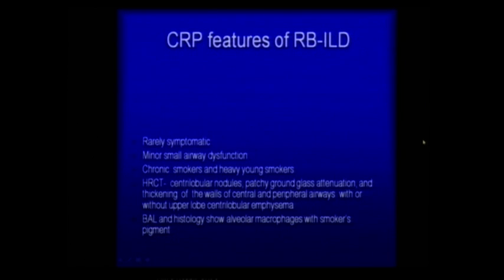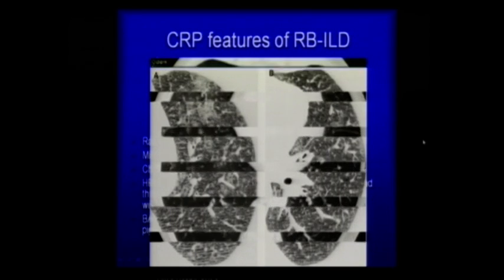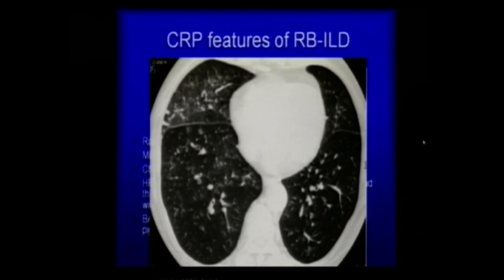Actually, since in the general population smokers are quite high, but they do not come to you for evaluation, you end up seeing fewer cases of RB-ILD and DIP, even though in reality it may not be the same. See, occasional respiratory centrilobular nodules only, and even a cessation of smoking itself might lead to an improvement.